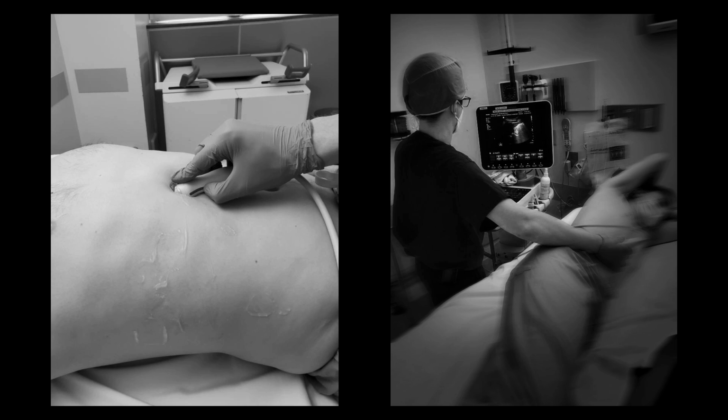And that can be challenging, right? And so if you are struggling seeing the windows that you need to see when the patient's lying supine, one of the things you can do is what we see on the right-hand side of the screen here: just roll the patient over to the left side. What that's going to do is pull that lung down. It's going to exaggerate that little window around the lingula and allow us to have a larger space where we can see the heart, right? We can get in and out of those rib spaces to see where that heart is, behind all those structures that block the ultrasound.